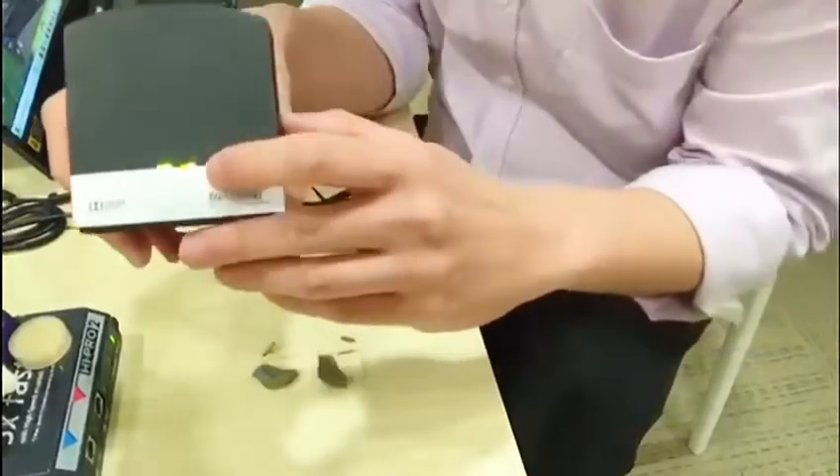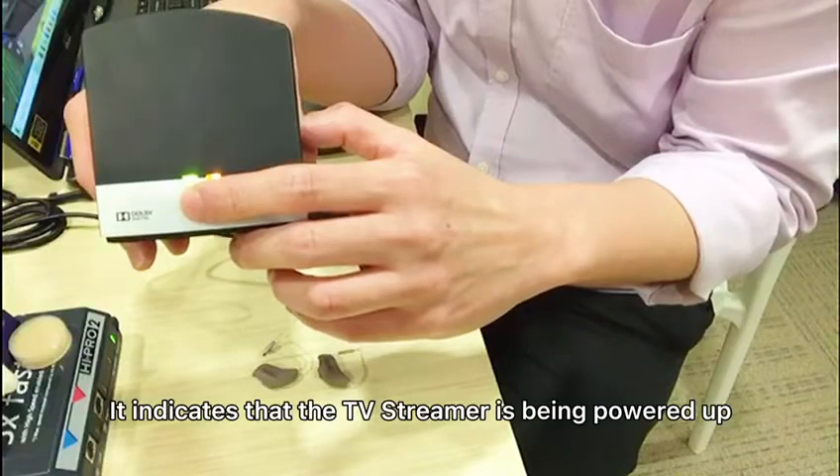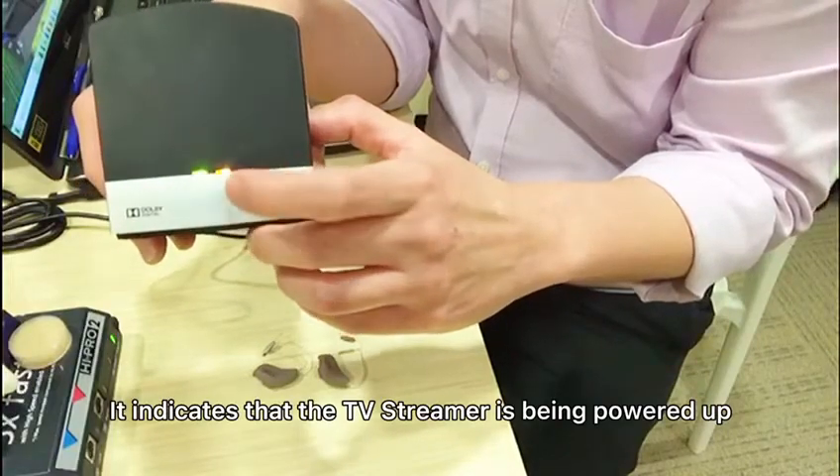Once you see both lights lit up, it indicates that the TV Streamer is powered up and streaming is successful.